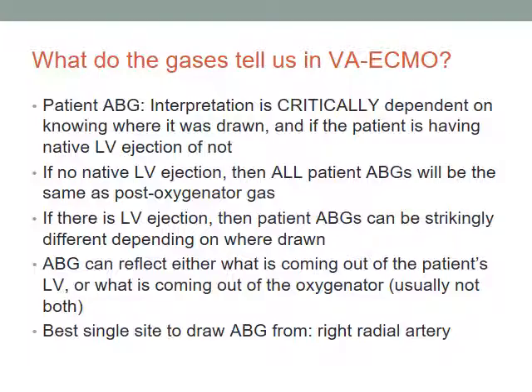Let's say you've got some sick lungs, you've got VA ECMO, and the heart is trying to pump, and it is, but it's pumping out blood that is hypoxic, and that's only going to worsen cardiac recovery issues. So a lot of challenges here.